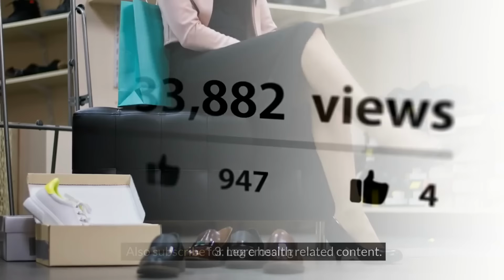Conversely, if the arm is above heart level, the reading will be artificially lowered, which might result in undiagnosed or underestimated blood pressure levels. For accurate and consistent readings, it's essential to position the arm at heart level. This ensures the middle of the cuff is at the same height as the heart, providing a true reflection of your blood pressure. Proper technique involves sitting comfortably with your back supported, feet flat on the floor, and the arm resting on a flat surface at heart level.